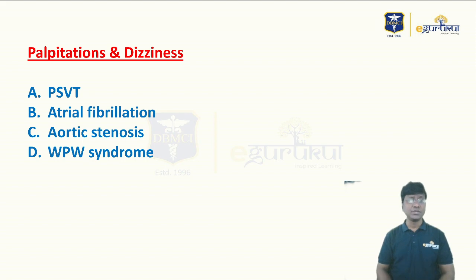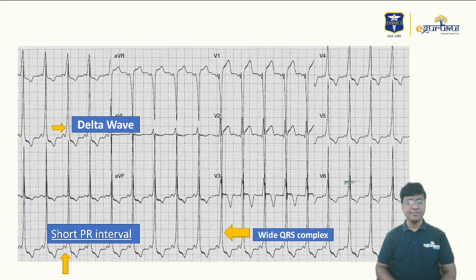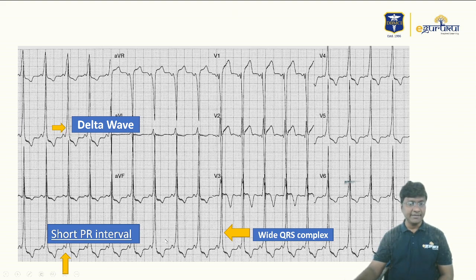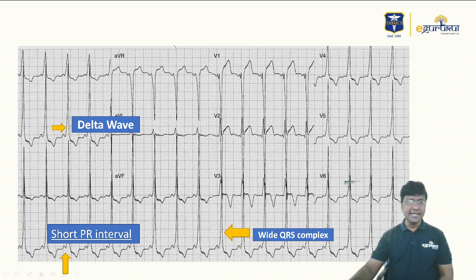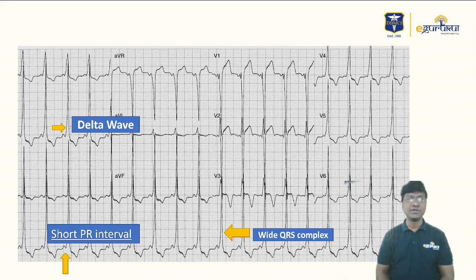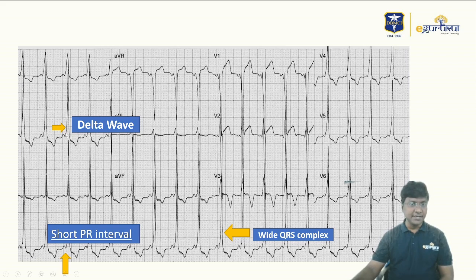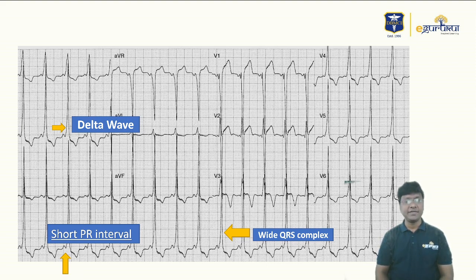You need to identify the abnormalities in this ECG. Number one, there is a short PR interval — I've marked it with an arrow. The normal PR interval is 120 to 200 milliseconds, and here it is less than 120 milliseconds. Second, there is a wide QRS complex — normal is 70 to 100 milliseconds, and here it is more than 100 milliseconds. Third, there is slurring of the R wave, which is the delta wave.